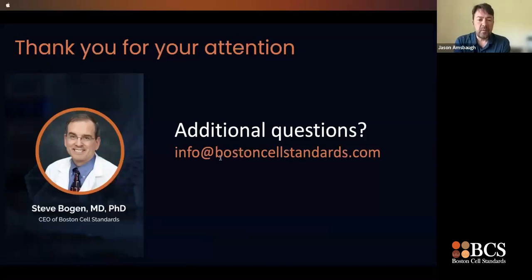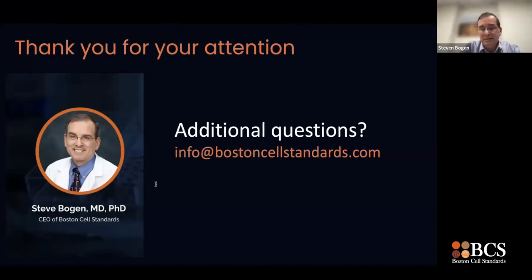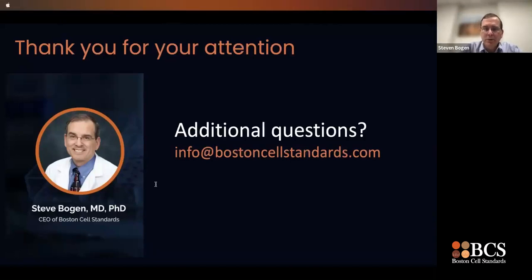The first question here: why did immunohistochemistry testing develop over the years without calibration, especially if it's a standard in other types of laboratory testing? So thank you. The answer is that calibration evolved in clinical chemistry as those assays started, and it was much simpler. For example, to get a sodium calibrator, we just dissolve sodium into a buffer. For immunohistochemistry, technically it just wasn't possible. There were no measurement standards to define cellular concentration of analytes.